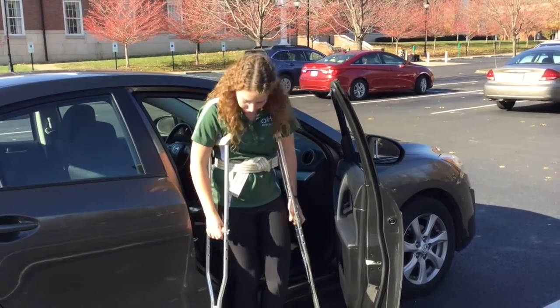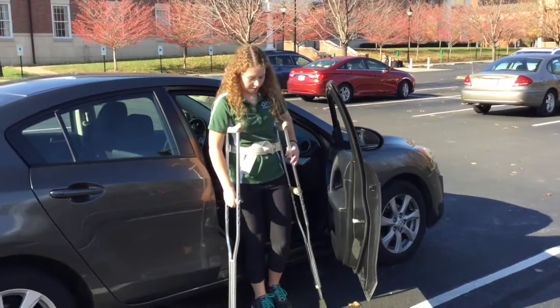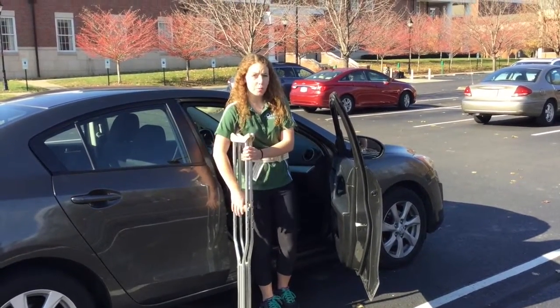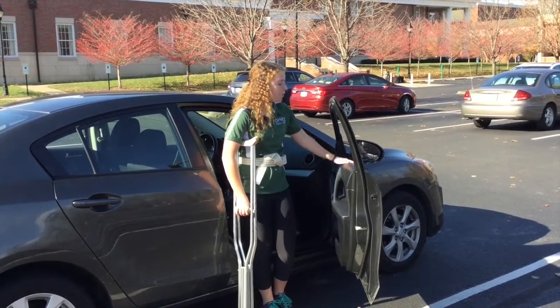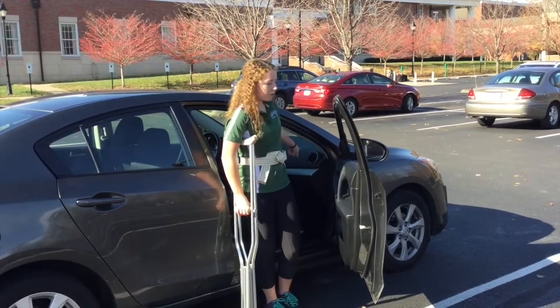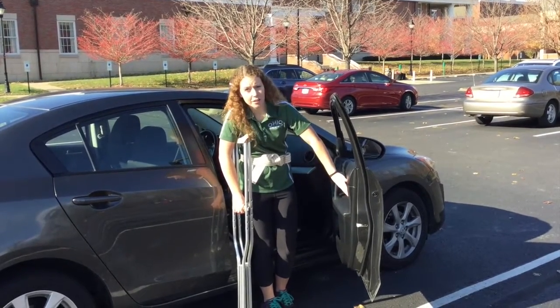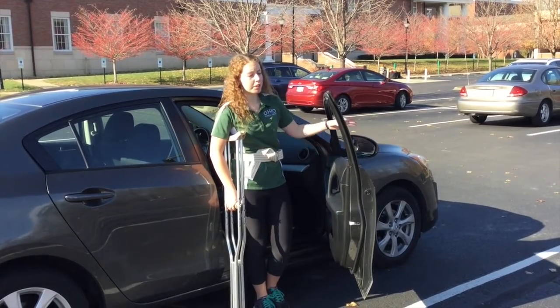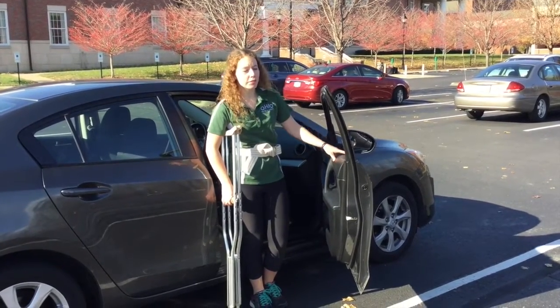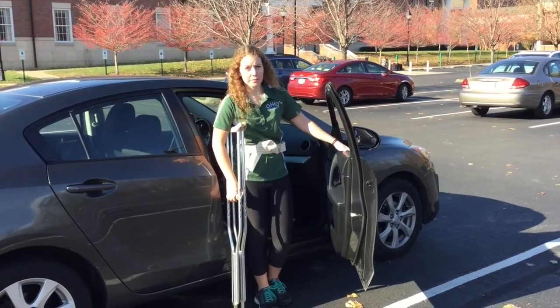And then once they're in contact with the car, you'll have them shift both crutches into the hand they use to open the door. And then with the free hand, they will either grab onto the window frame of the car or the dashboard, or you can have a grab bar installed in the door of the car. And one thing you want to remember with this is if they're using the window frame, you want the window to be completely rolled down. You never want them to grab onto the glass of the window.